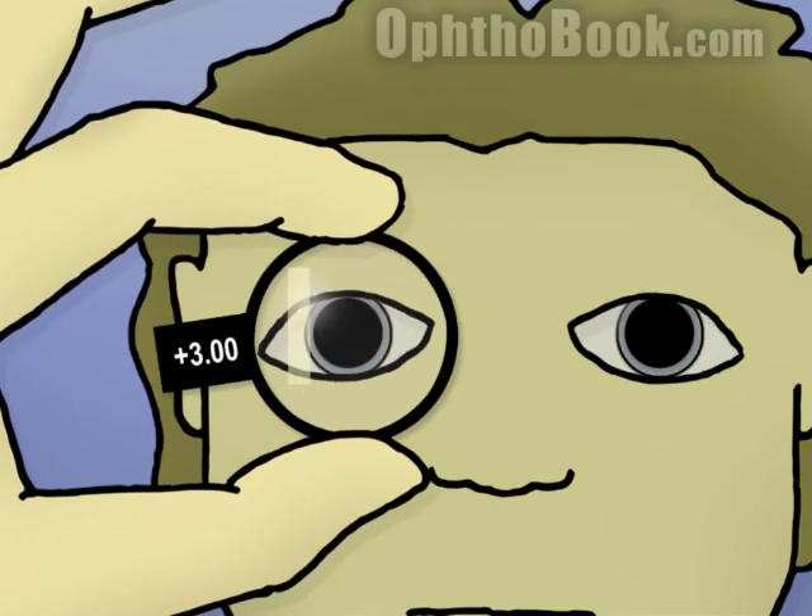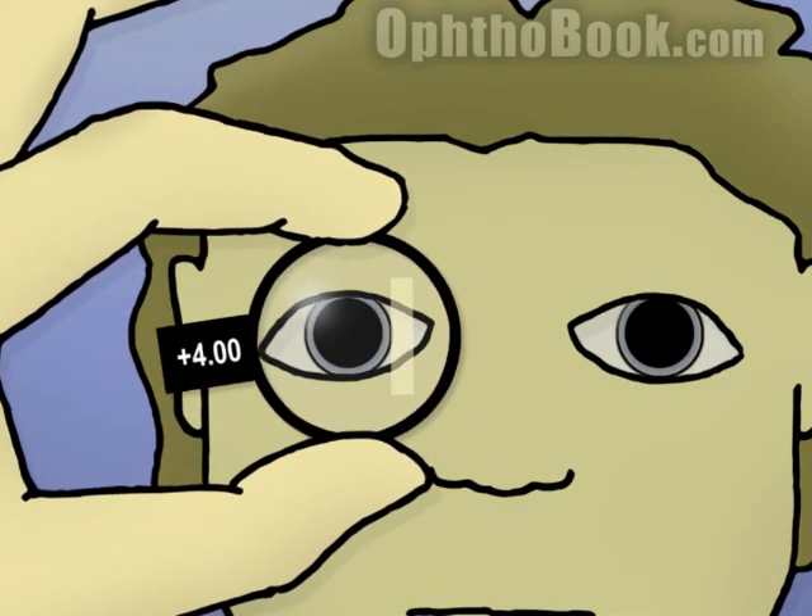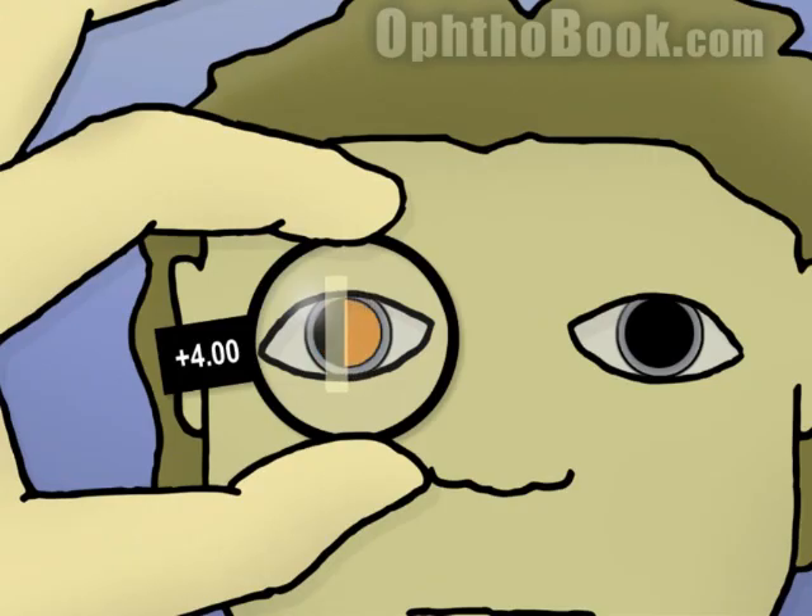So let's try plus three — this is it. You notice that the whole eye lights up as soon as that light gets over the pupil. This is the perfect focus, and this is the right prescription for this eye. If you go too far and add too much power, it focuses in the middle of the eye and you get that seesaw, that 'against' motion. If you've gone to against, you've gone too far. So in this case, a plus 3.00 lens was the right prescription for this eye to get it in perfect focus.